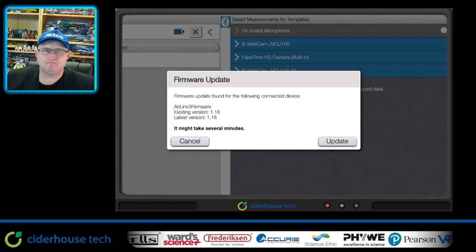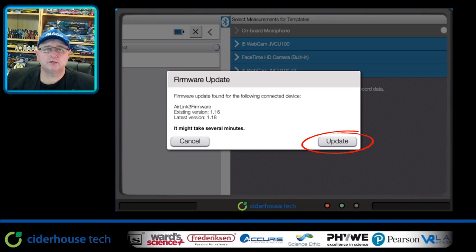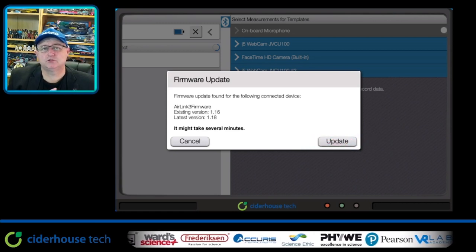The next reason usually is that you haven't updated the firmware of your sensor. So when this little screen comes up on your screen, make sure you always press yes. That way the sensor will be completely up to date all the time and you won't have issues with it dropping out, etc.